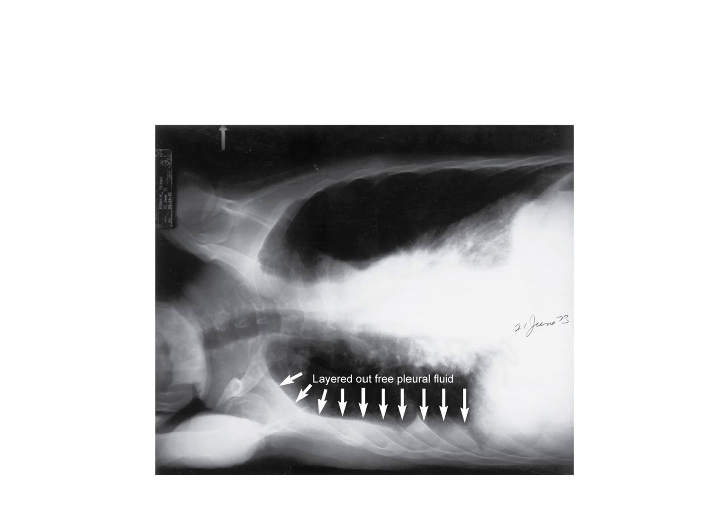You'll see this picture here, and I'm reading through it and it's not really saying what side, but as I'm looking at it again, I can see now there's a little ID plate, and usually it's on the top part of the film here in the corner. That's usually on the left side. So it looks like he's lying on the right side because the heart does look like it's taking up more space here on the left, on the top part of the lung. So this is a right-sided pleural effusion, but you can basically see how the fluid level here is layering out, and again, it being gravity dependent.